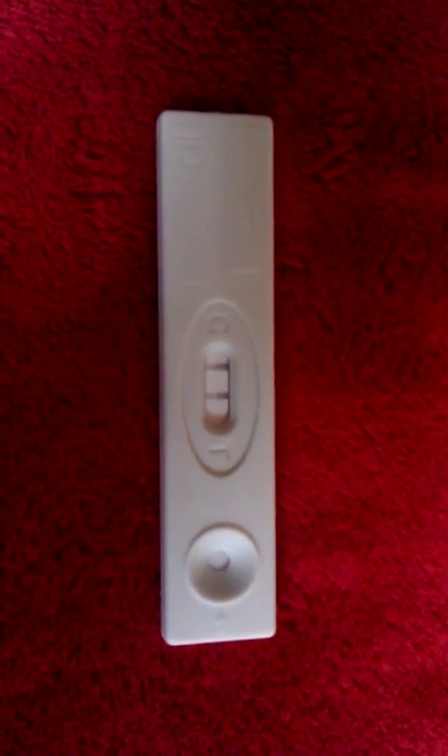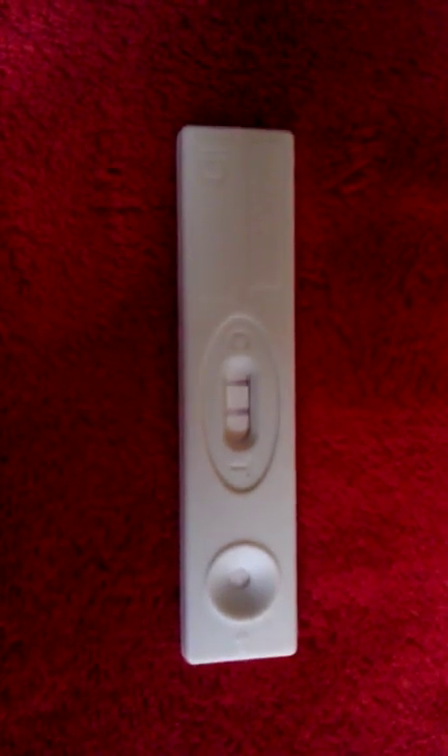Hi guys, it's me Steph. I just wanted to share this experiment I just tried out because I'm so curious about how this whole HCG thing works. I wanted you to see the results of a pregnancy test where I put the HCG — I just put the liquid in there, not human urine — to see if my HCG was pregnant. Somebody asked me: if you used urine, would it show a positive pregnancy test? I said probably not.